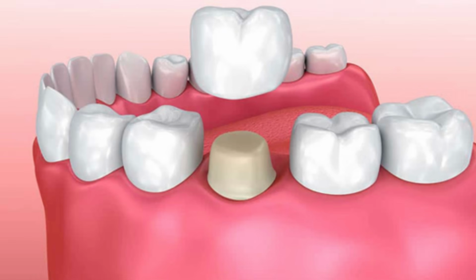It has to be uniformly tapered and rightly beveled with bevel locks, and you have to give proper finish lines, chamfer, shoulder, whichever is required, using new burrs. What I usually see is people taking the crown, cutting the top of it, making a pit in the mesial and distal, and that's it, the crown prep is done.